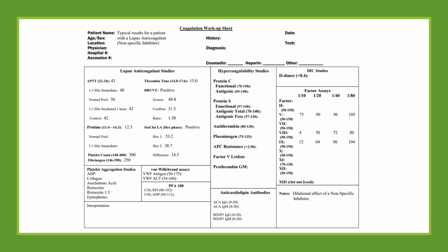Now, if a patient does have a clot or hypercoagulative state and is beginning to clot inappropriately or even appropriately in some cases, we are going to measure the fibrinogen degradation or the fibrin degradation products with our D-dimer testing. Although fibrinogen and fibrin are both broken down by that plasmin, we are going to measure only the fibrin degradation products in the form of those D-dimers, which are just the byproducts of that breakdown.